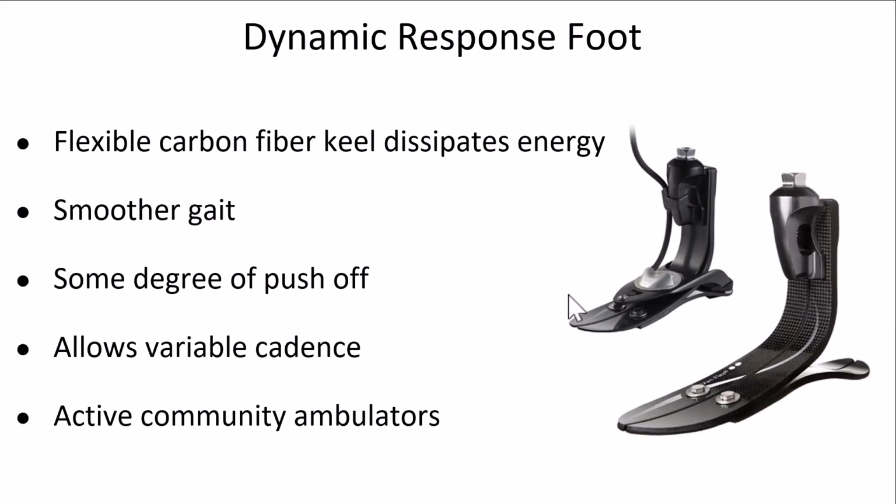The dynamic response foot is shown in a picture on the right-hand side of the slide, and this is typically a flexible carbon fiber keel that helps dissipate energy. It results in a smoother gait overall with some degree of push-off and allows for variable cadence. And this is a perfect kind of foot for active community ambulators.